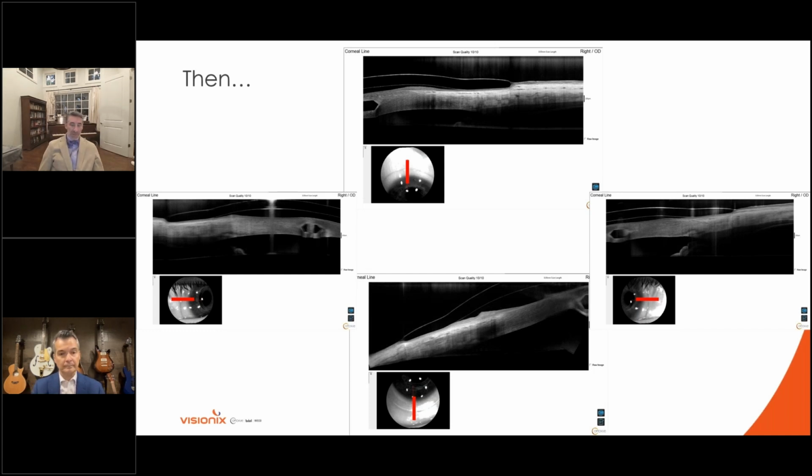And what those papers established for us in the industry is that you really should be shooting for 200 microns of vault. Now, the paper didn't say when you should get that 200 microns of vault, whether it's right when you put that lens on, or if that's at the end of the day.